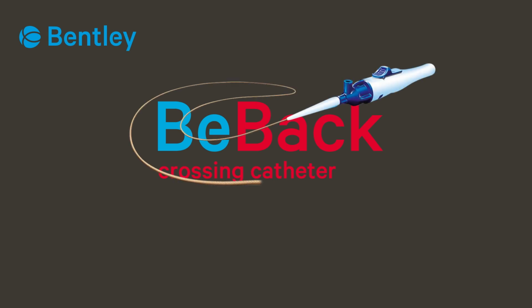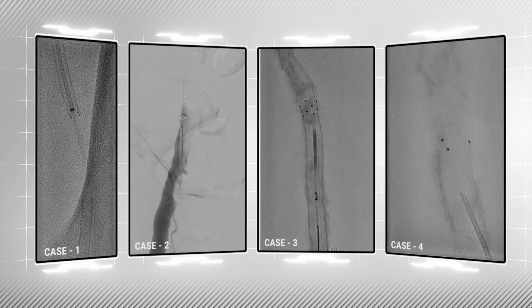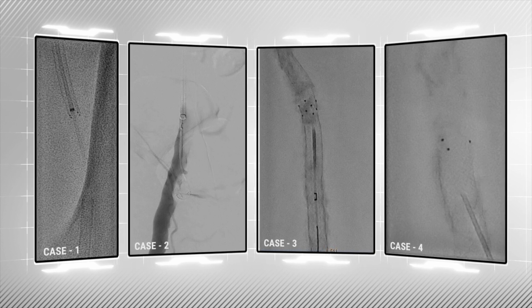This video presents a variety of BeBack cases, ranging from the classic CTO crossing to some of the more innovative and novel applications of the catheter.